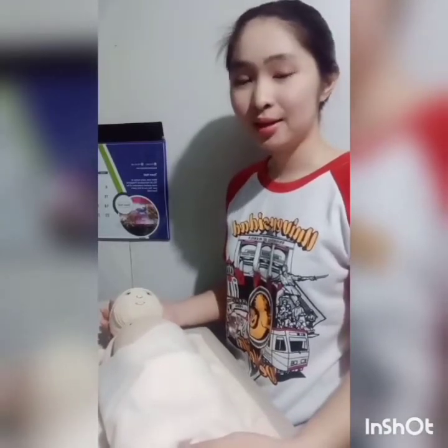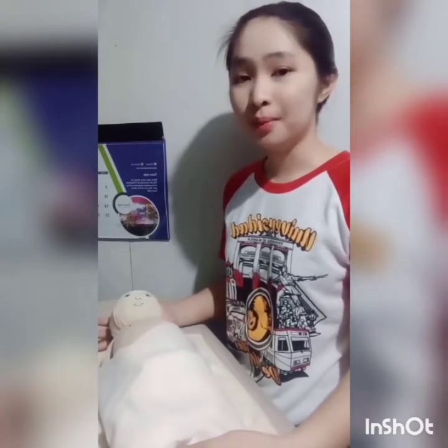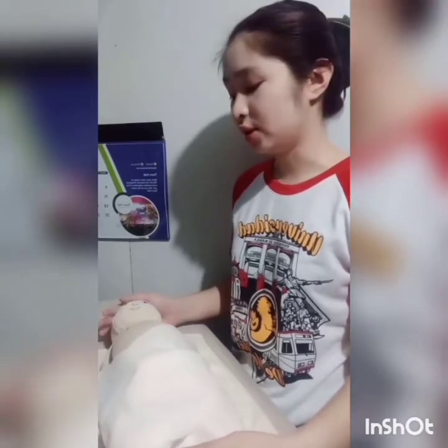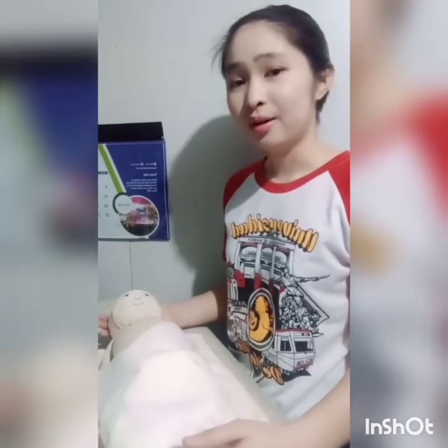So today I have here with me baby Emmy, and I'm going to perform assessment on her anthropometric measurements. So that includes measurement of her length, her weight, and her body circumferences, such as the head circumference, chest circumference, and waist circumference. So baby Emmy is 42 weeks gestational age.